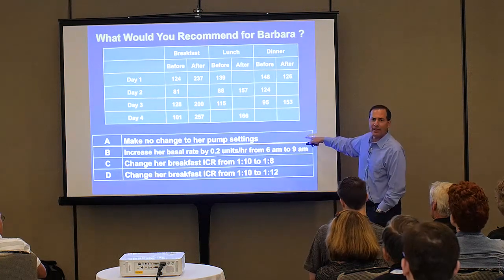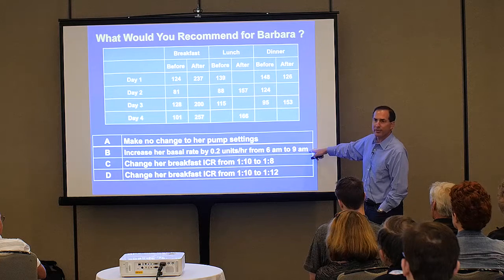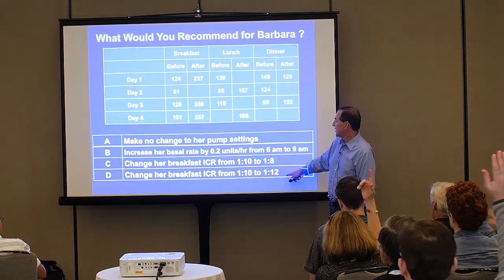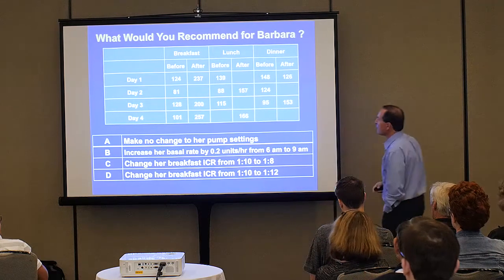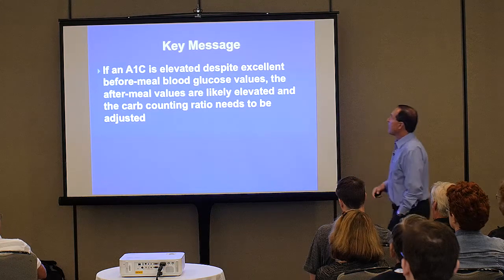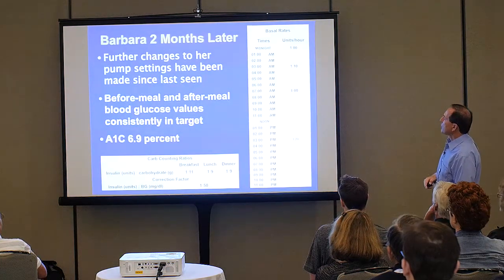Okay, so who votes for A? Who votes for increasing her basal rate? Who votes for strengthening her breakfast carb counting? And who wants to make it weaker? Okay, so we have more or less of a consensus to strengthen her carb counting ratio at breakfast. And okay, so we did that.